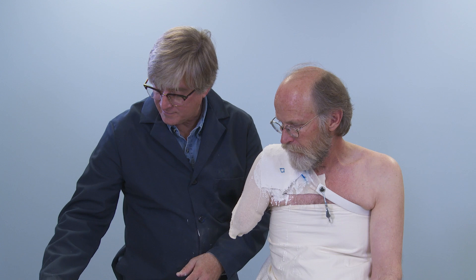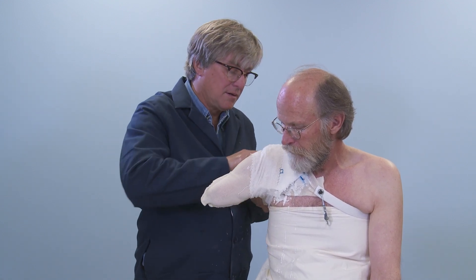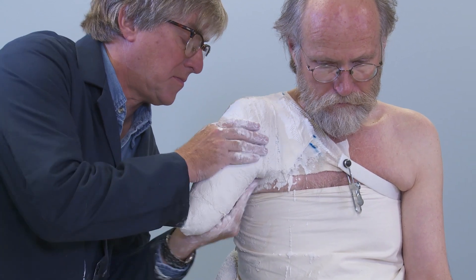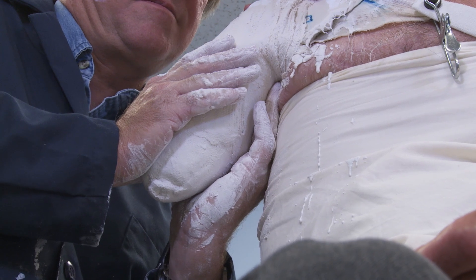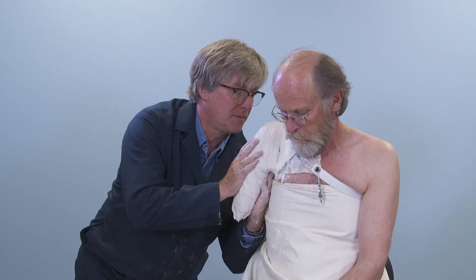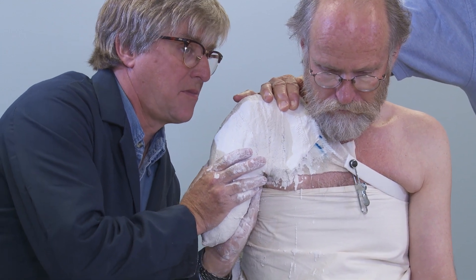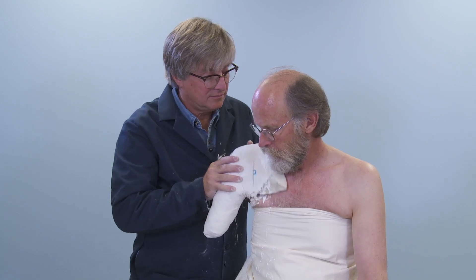Wrap the soft tissue portion of the arm with the 4-inch roll of plaster of Paris bandage. The patient can slightly abduct the humerus to allow the practitioner to bring the roll flat through the axilla. Encompass the entire residual limb with 3-5 layers of plaster bandage. Place the fingertips of one hand in the axilla and gently push superior into the axilla — too much superior force will be uncomfortable, but not enough will not demarcate the pectoral tendon and latissimus dorsi. Use the palm of the other hand to form the ML dimension of the mold. The contour of the humerus can be formed with this hand. At the same time, maintain the humerus in as much adduction as possible. Take note of the splints to ensure they have stayed in place and not shifted as you adduct the humerus. Take care not to deform the medial wall, but form a flat surface medially. Once this plaster has hardened, remove the mold.